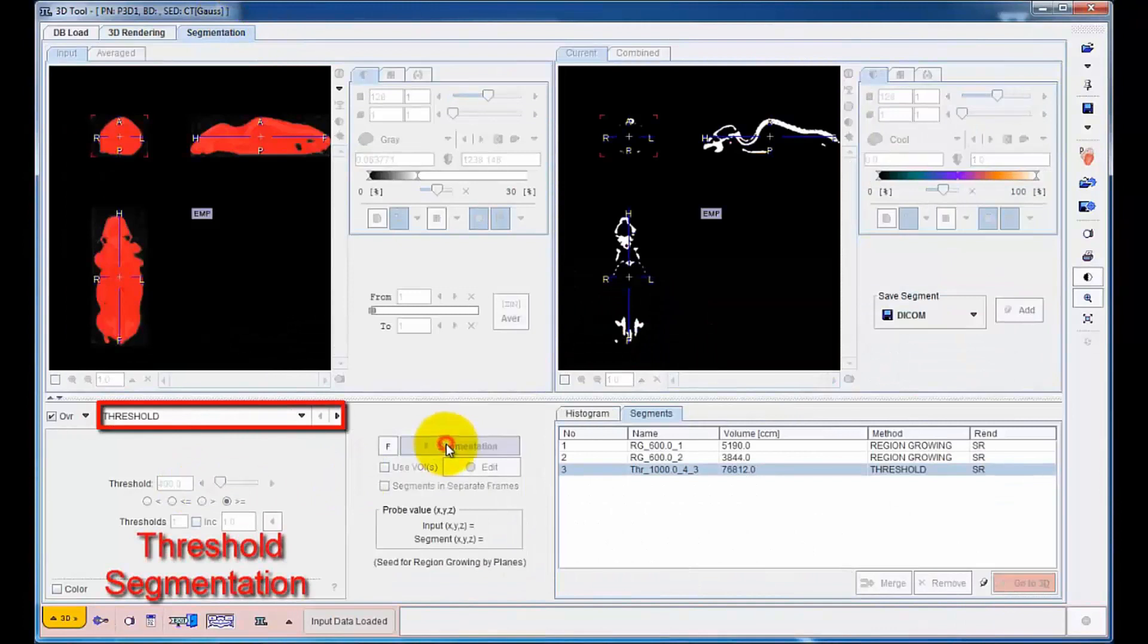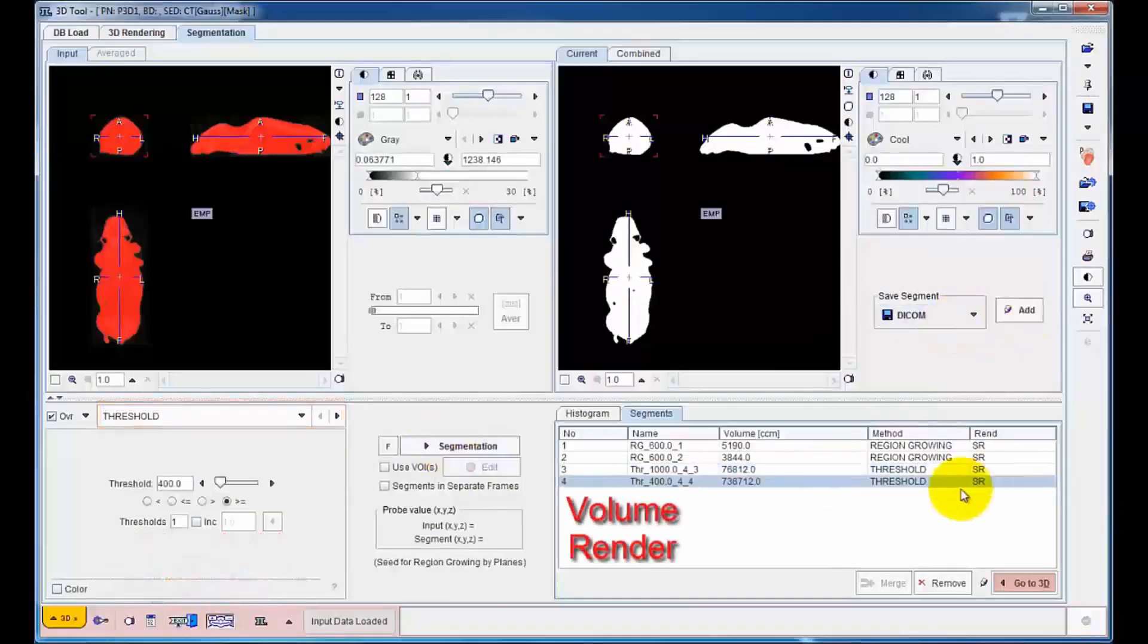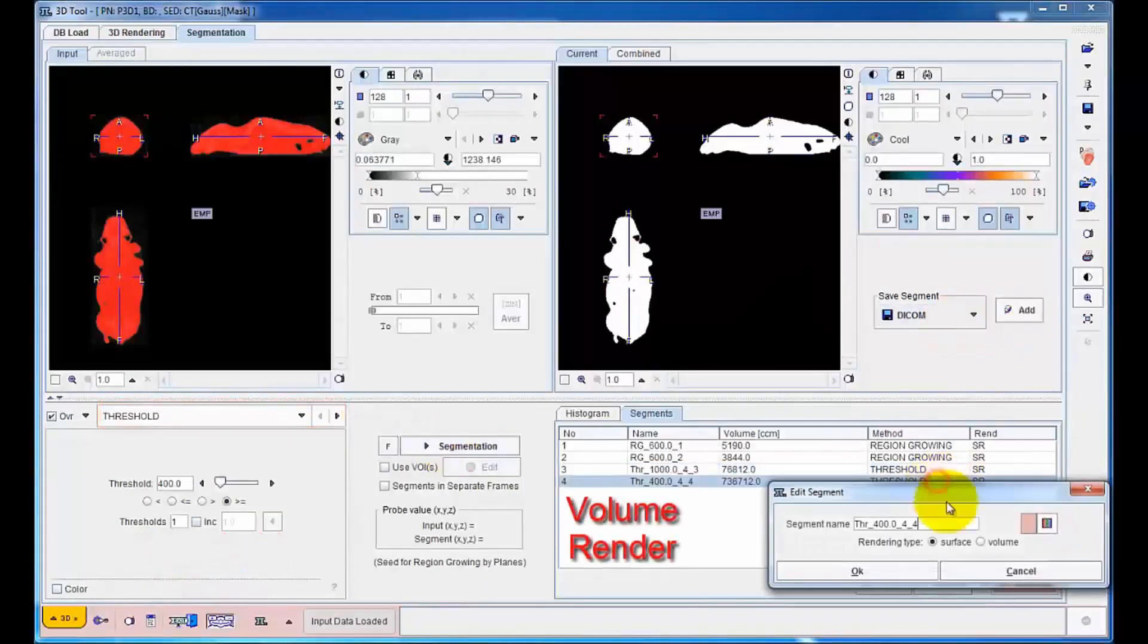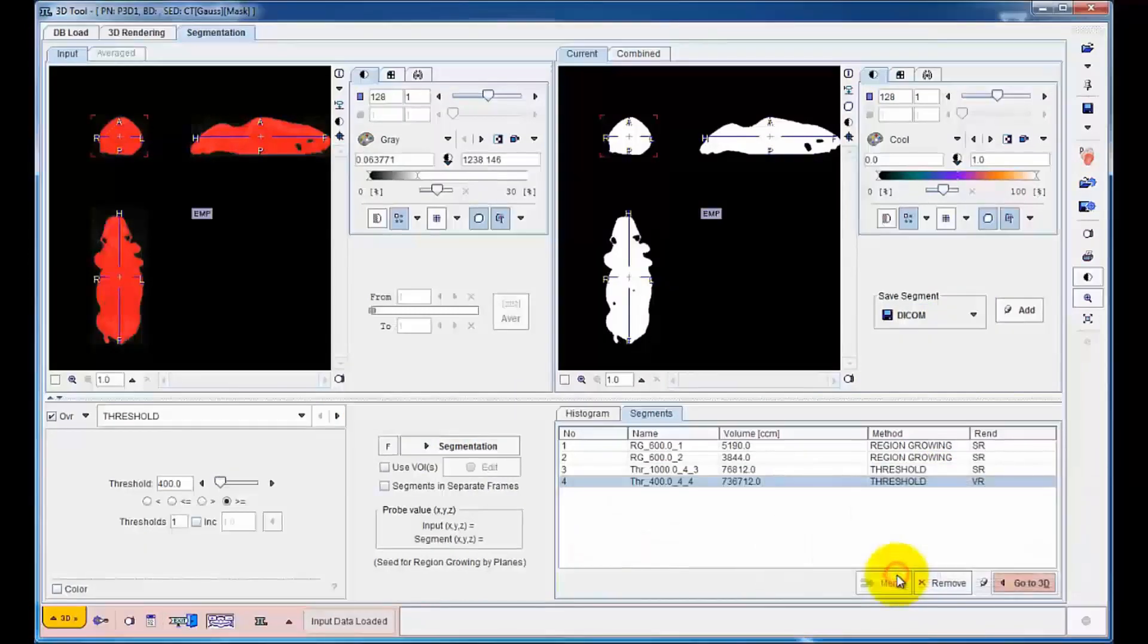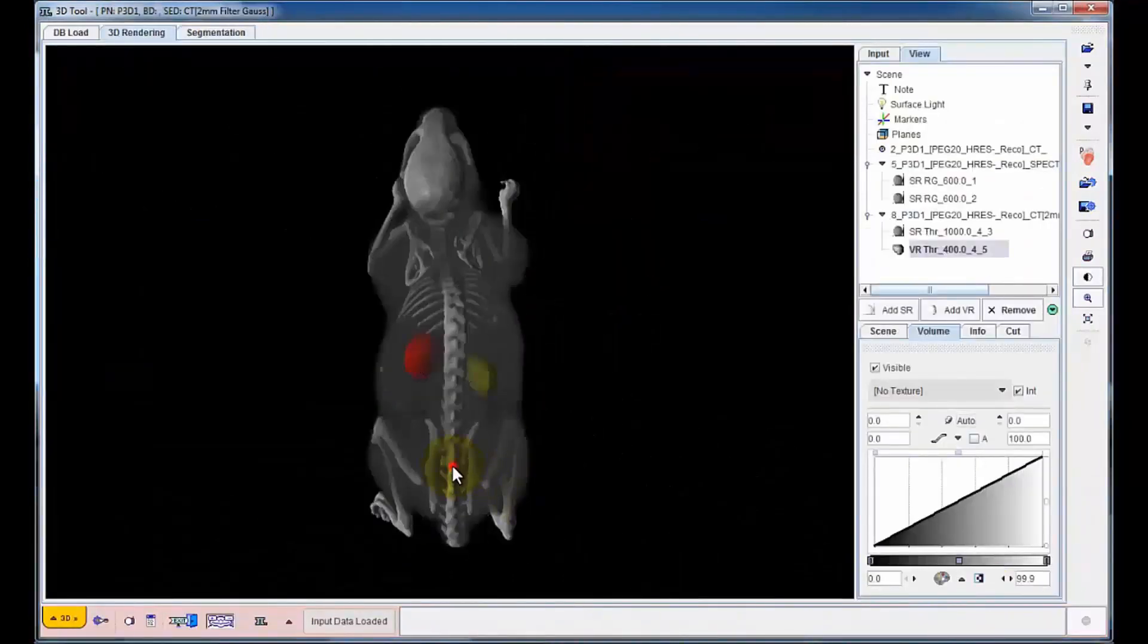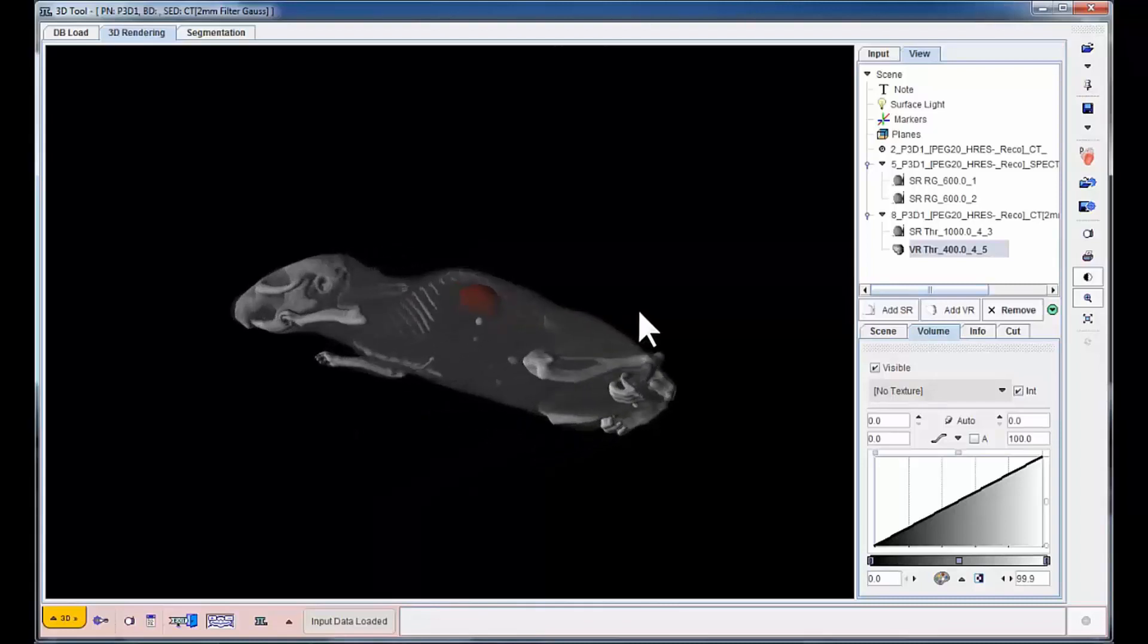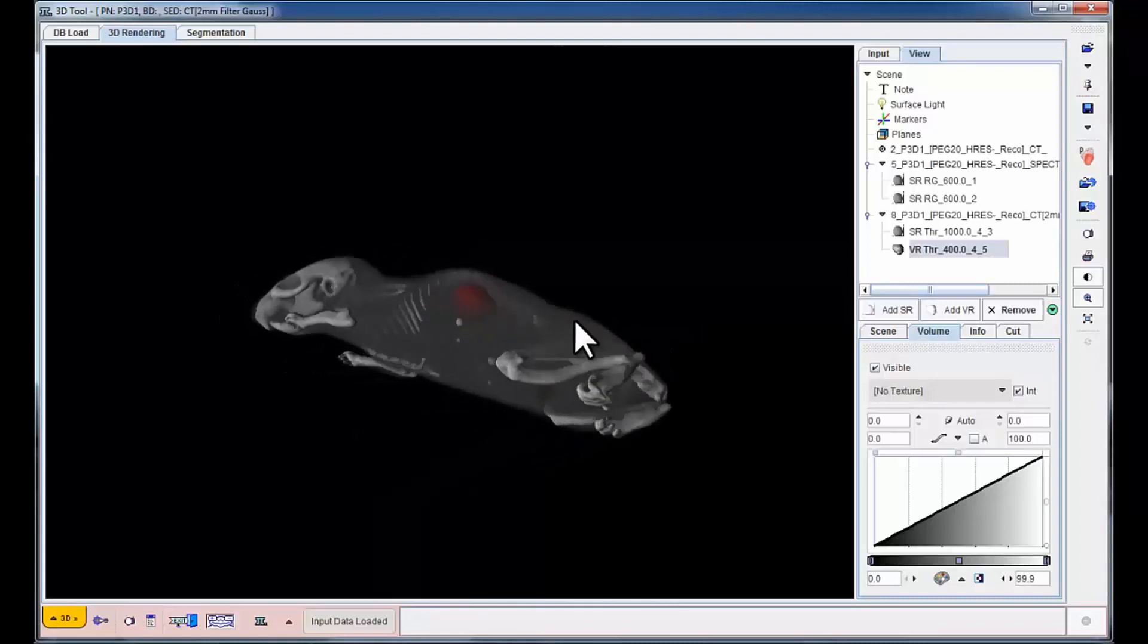The soft tissue information is then added by volume rendering all body pixels. The result yields a relatively low resolution impression of the body volume surrounding the inner skeleton.